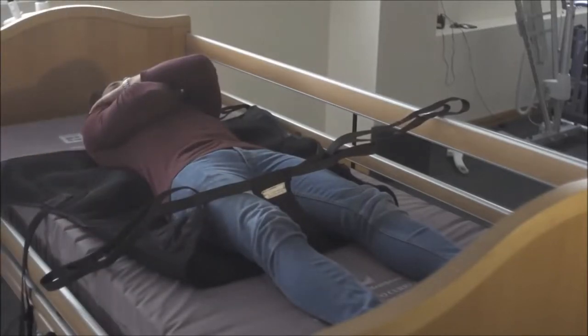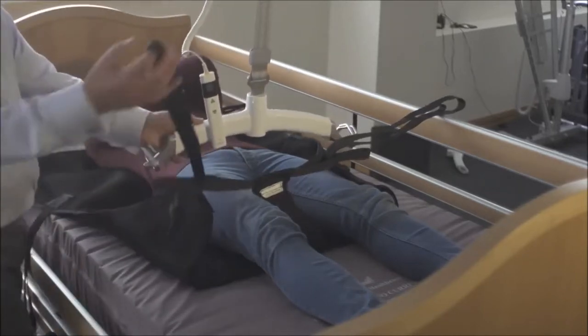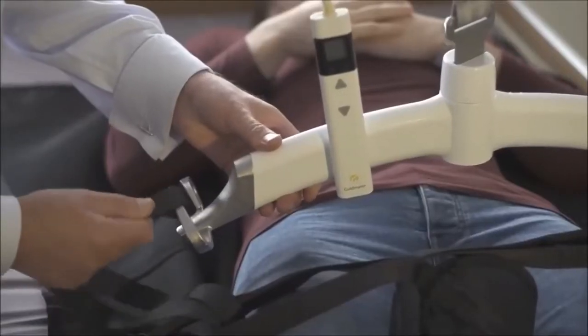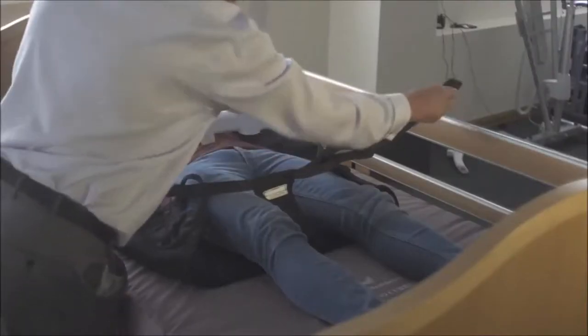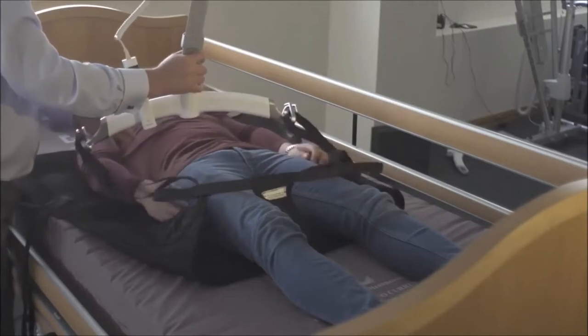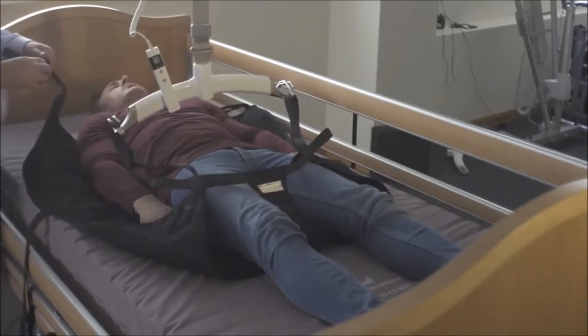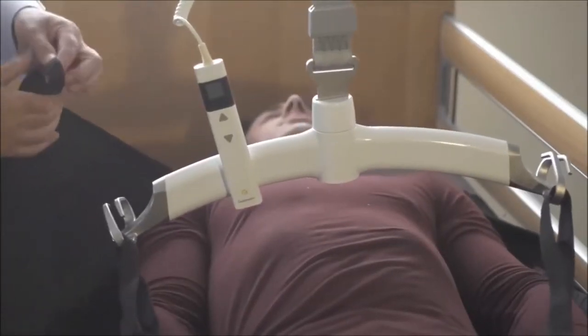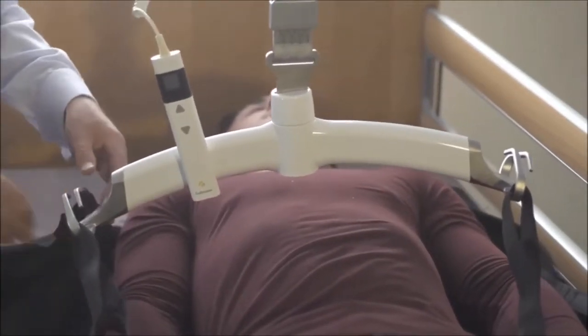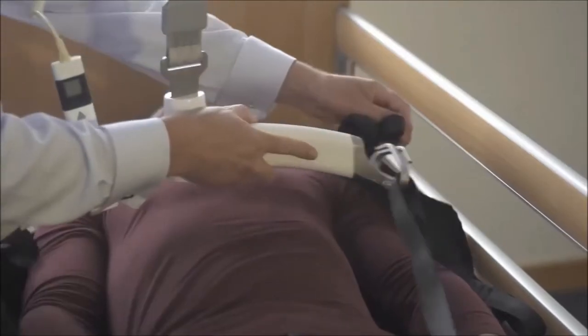Okay, and then we're ready to bring in the hoist. We unhoist, and because you're going into sitting, we hook up the long leg piece and the long leg piece on that side. Just put your arms down by your side, Phil. Then we'll put the short shoulders on — expose the short shoulder loop which is closest to the sling, hook that on there. And the short shoulder, which is closest to the sling on the other side.